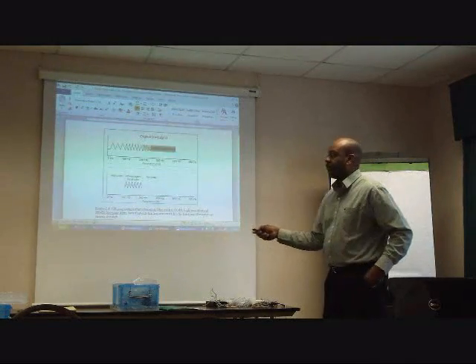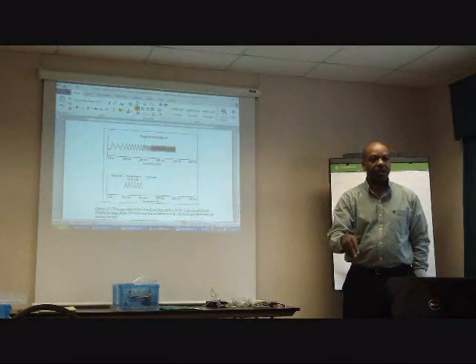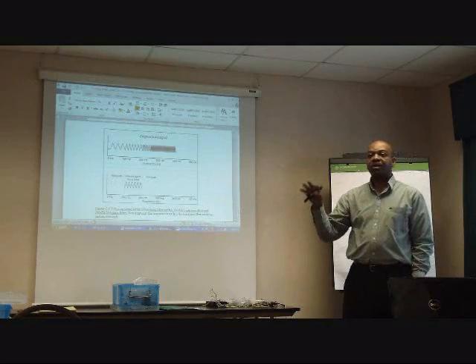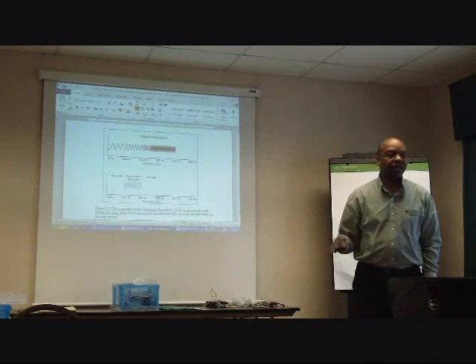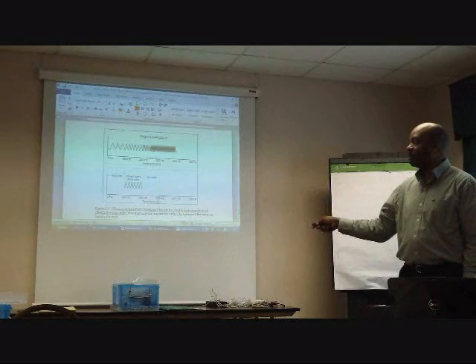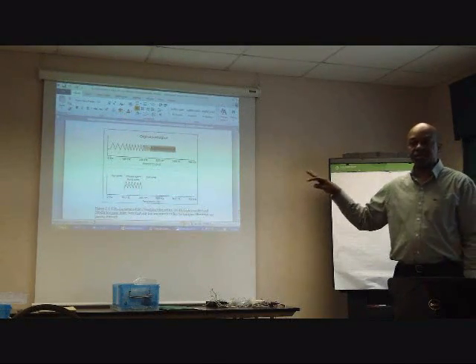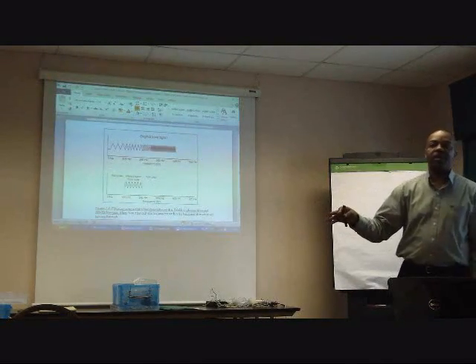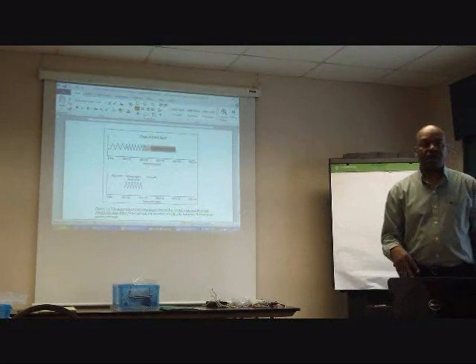So here we're just defining what we're going to be looking at. And then when we see the reading that's going 3 microvolts, 5 microvolts, 10 microvolts, 2 microvolts, that's amplitude. That's the power that's within that range. Now, when you're just looking at a signal on an EMG, you don't really need to get into all of that, but this is just so you have the background of what it is you're looking at. And for instance, why you might switch to a narrow filter sometimes and a wide filter other times.